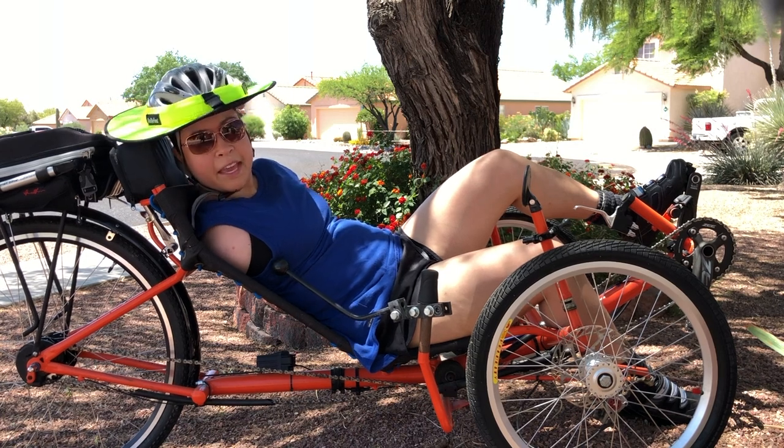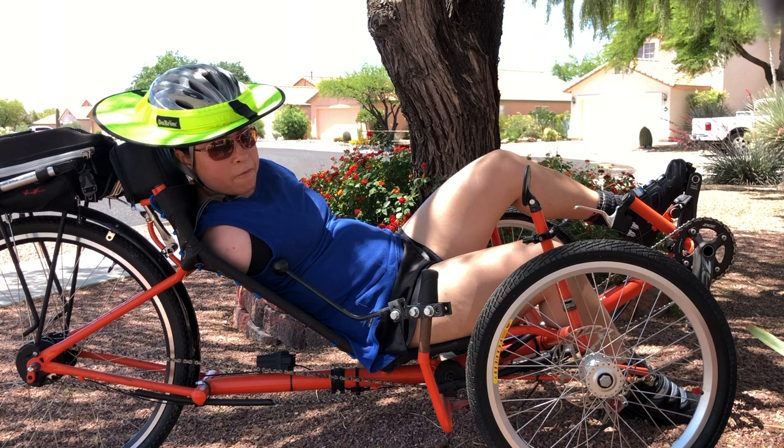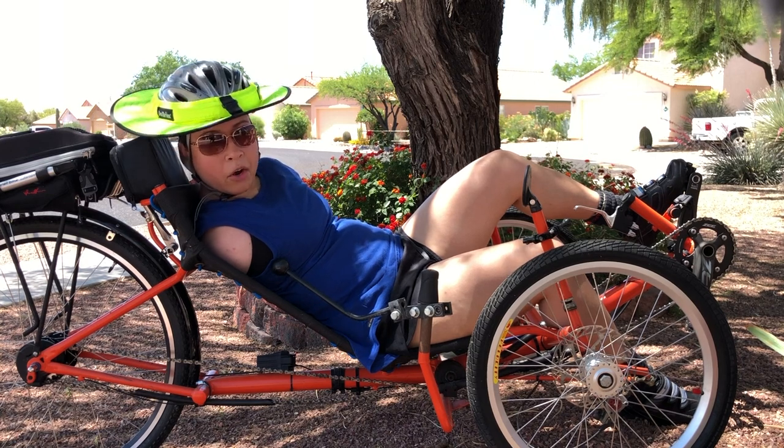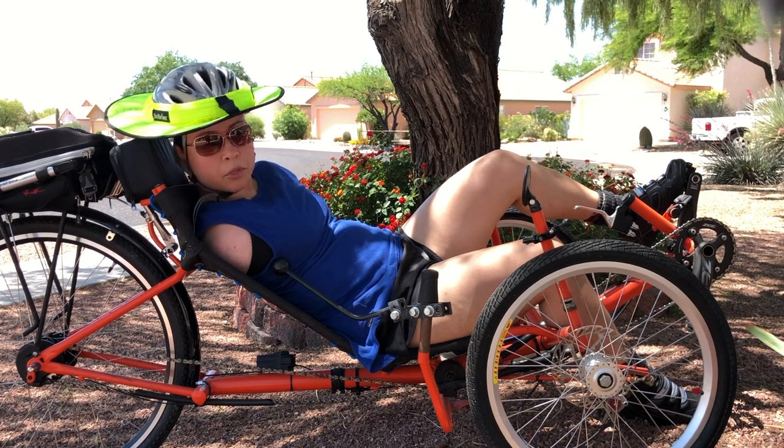That's how I'm able to steer this thing. We're still developing a way for me to steer at a very sharp angle. I can steer wide turns, but when it comes to sharp turns I'm still a little bit limited, so we're working on that one.